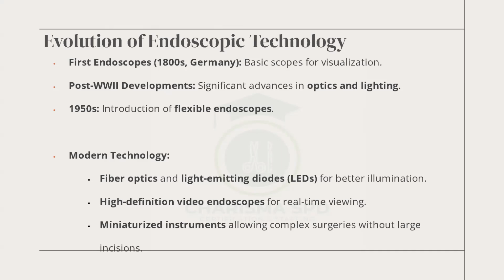Then the 20th century introduction of flexible endoscopes. The idea of the endoscope is not new, but they have been upgrading them. And I'm sure 100 years from now, when none of us here will be around, some people will have a different conversation about endoscopes.